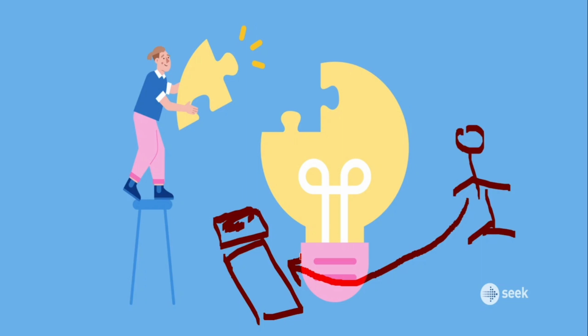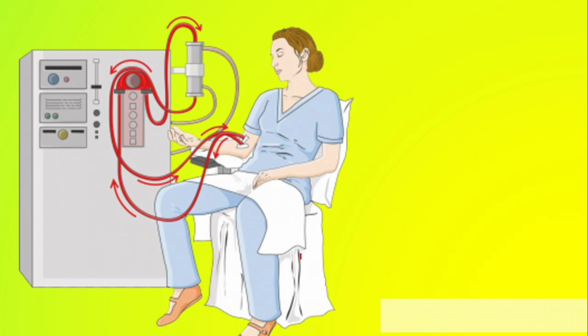And the speed at which the venous blood can be sucked out in the artificial circuit is also limited. You can't take blood at, for example, 150 ml per minute or 200 ml per minute. You can't do that because the vein won't have that fast a supply of blood. So these are the two important problems. See, this is the machine. The blood has to come from the patient and go back to the patient. Even in the current days, where will we take the blood from? So this was the major problem in the beginning.